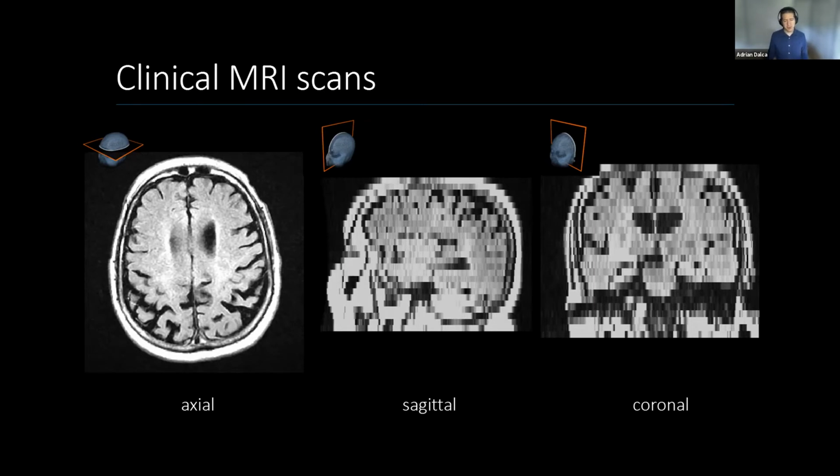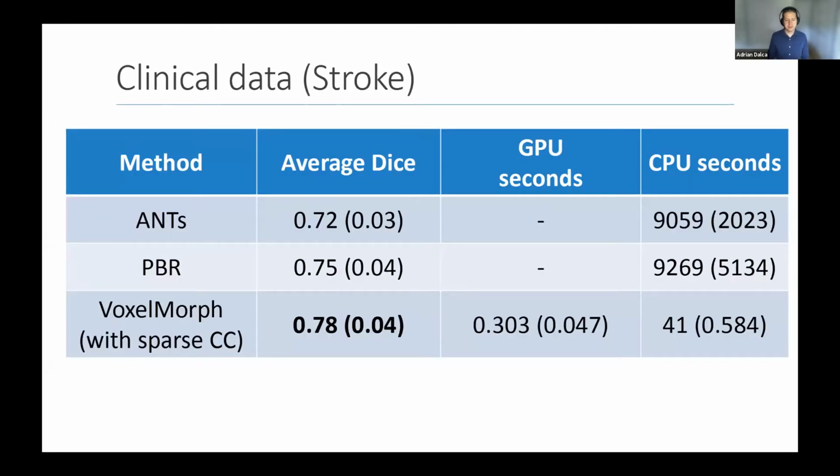In fact, almost out of the box, the VoxelMorph models that we trained did substantially better than really carefully fine-tuned classical models. During my PhD, we spent, I think, a year and a half fine-tuning the baselines really carefully. We got to about 72, maybe up to 75 Dice points for some structures. And then we ran VoxelMorph with just a changed loss function, and we got 78.